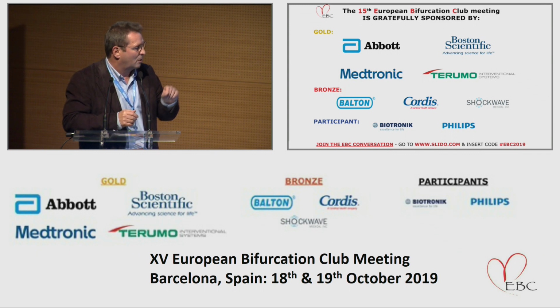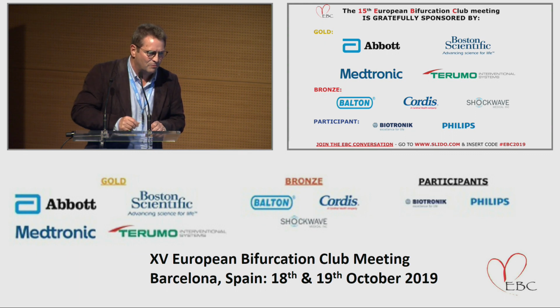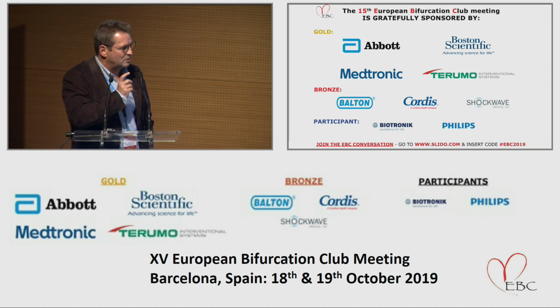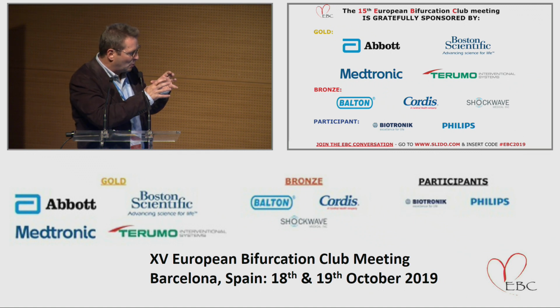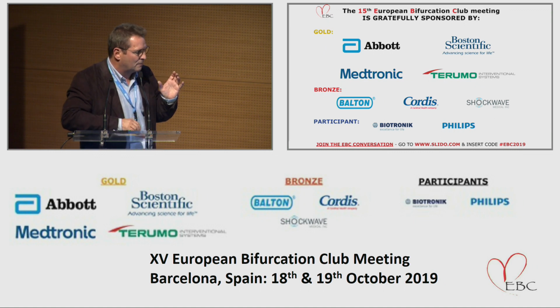But if you go up where you have the 4 connectors, it would be, I can't remember, 5 point something, I guess. So you have to actually be aware that this stent has a special design. It has more connectors in the top, it has more longitudinal compression resistance, and it has a better scaffolding, which makes it very good for the left main ostium.